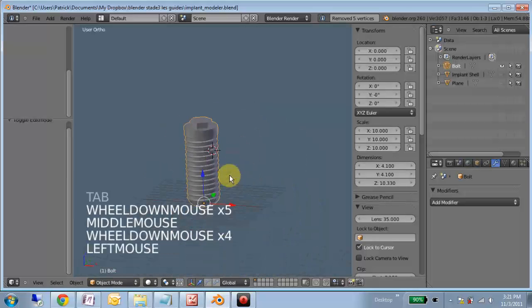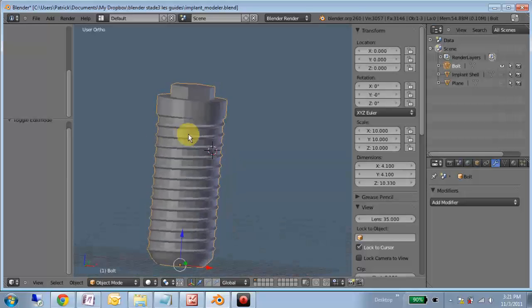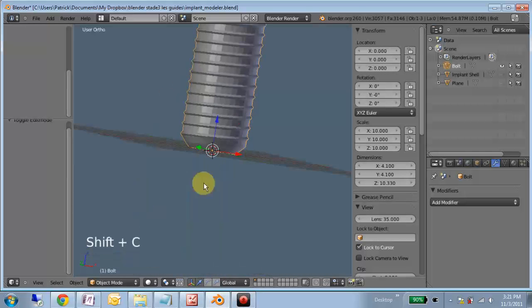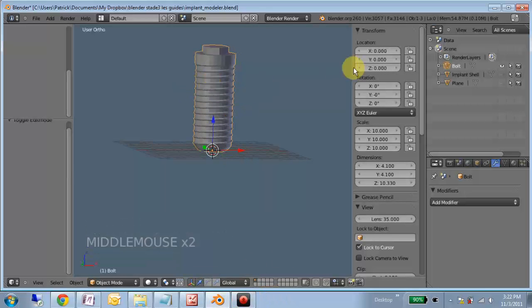Okay, so there you have that. That is a slightly better modeled implant. So sorry for the little confusion there at the end and a little bit in the middle, where I kind of spent too long explaining the adjusting of the plane. But hopefully that will get people started on modeling with the threads.